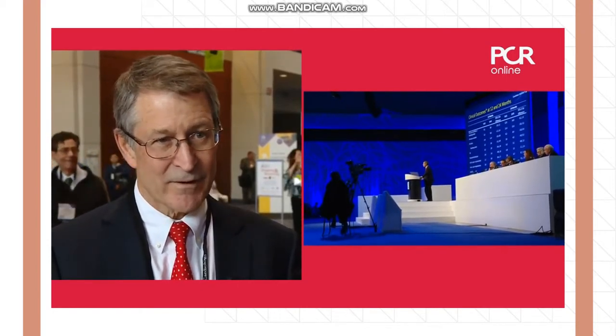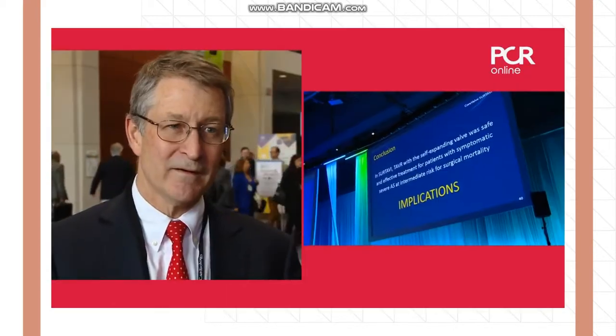Pacemakers were higher than we expected in this trial, but again, only 16% were Evolut R. We know from our data from Europe and our data from the US that the pacemaker rate in Evolut R has been lower than it is in the CoreValve Classic. We'd expect it to be about 13%.